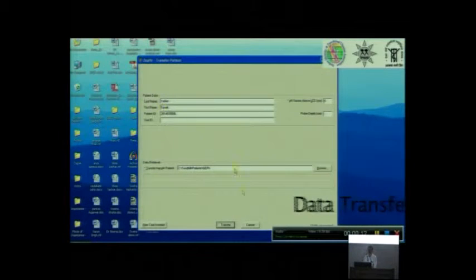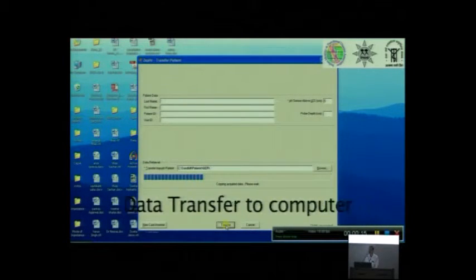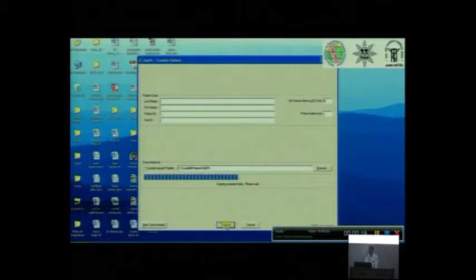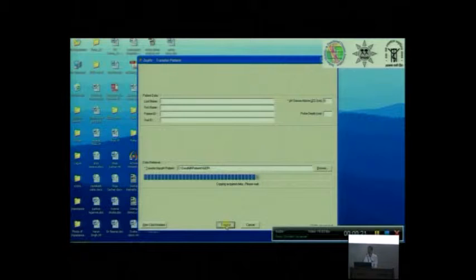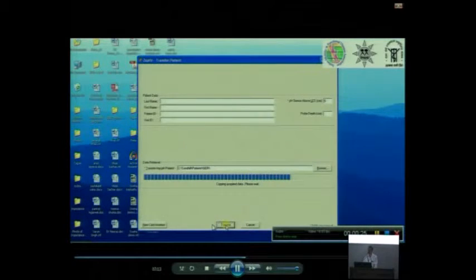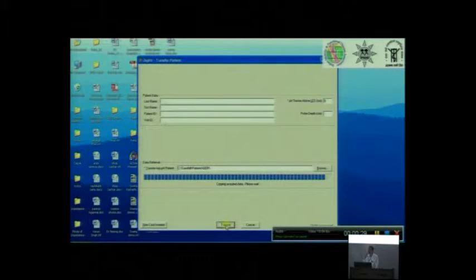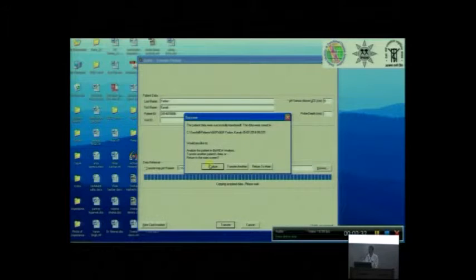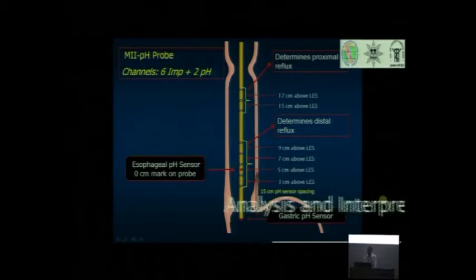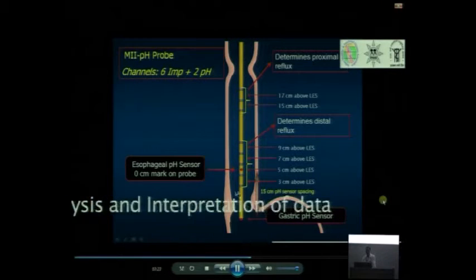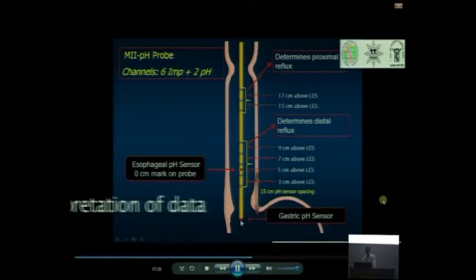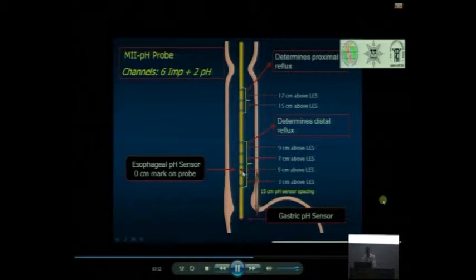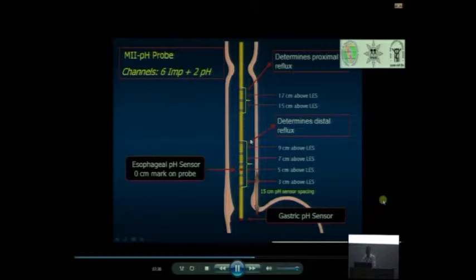Now you download the data. What you do is connect back to the computer the flash drive, and then you say download the data or transfer the data. Look at this, this is a transfer key. The moment you click, it will transfer all the data that we acquired during the pH metric, and then once you have transferred, go to analyze. This is our probe where you have two acid measuring probes or pH probes. This is the gastric pH sensor, and this is the esophageal pH sensor, and these are the impedance probes.